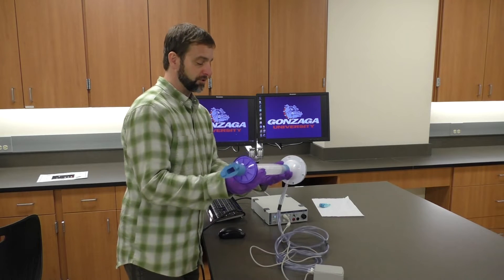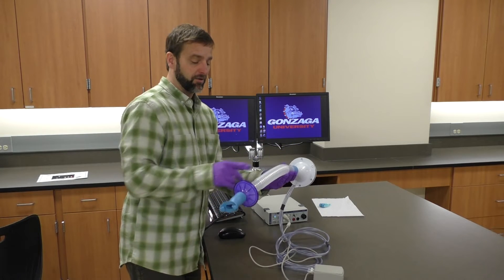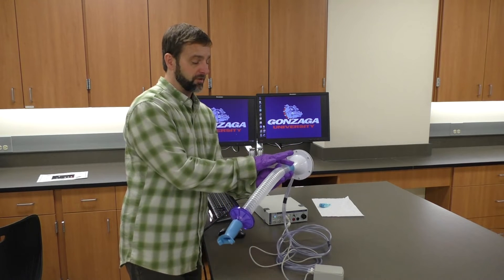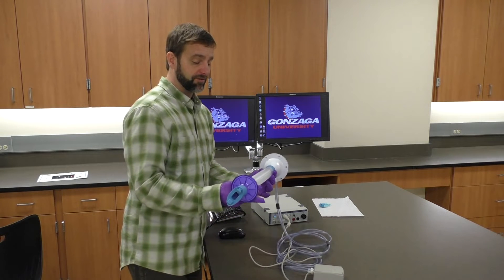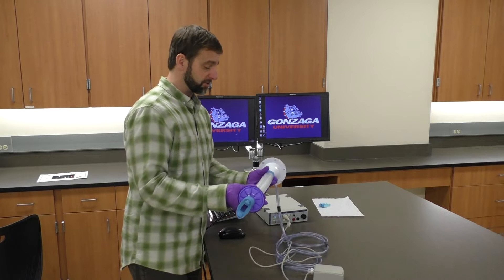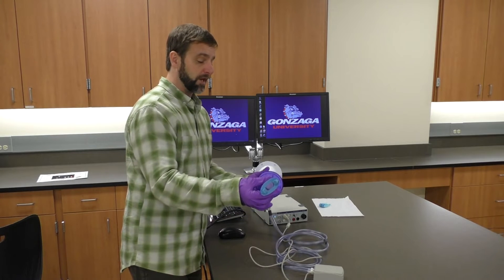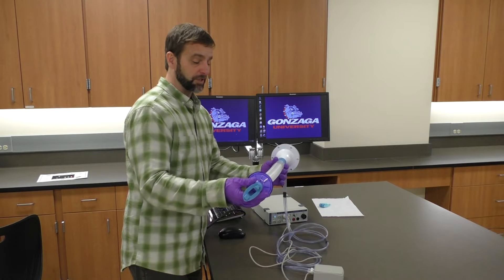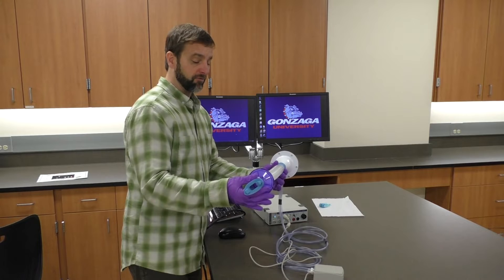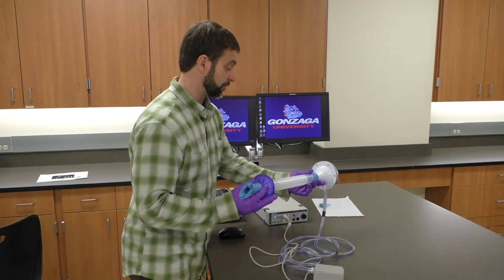This setup is single-use for each subject. If we're switching subjects, we want to switch out everything from this purple or blue adapter back, and that gets disinfected in Cavicide. Cavicide is the liquid we use to disinfect all of our reusable items, and we're actually going to create a separate video on the Cavicide protocol since it's used with most of our equipment.